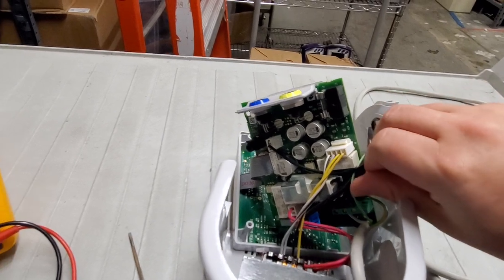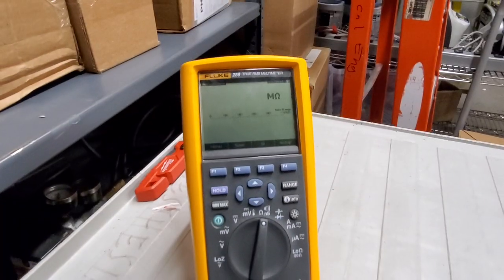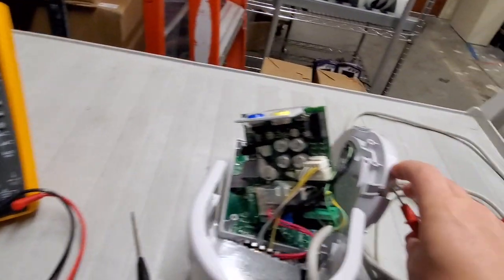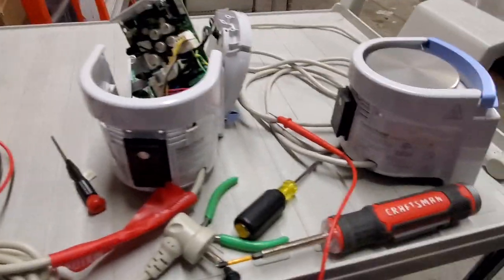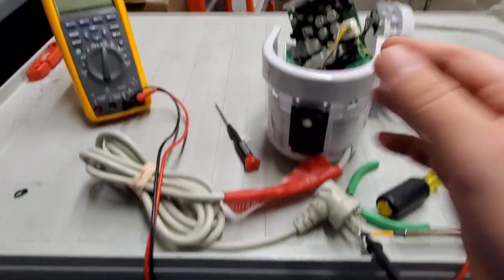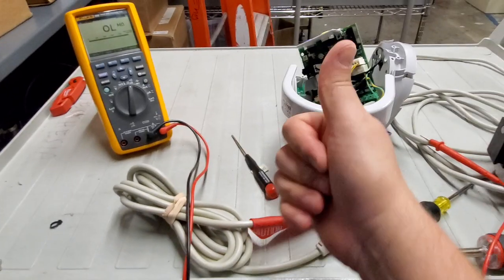But anyway, guys, that's it. When I connect to the power cord itself, we are getting, let's see, 2 ohms. So that will never pass electrical safety. And I've got so many of these that are like this. This one here is one of them. And there's no physical damage, no nothing wrong with it. It's just for whatever reason, something's going on inside the power cord and the resistance is spiking.